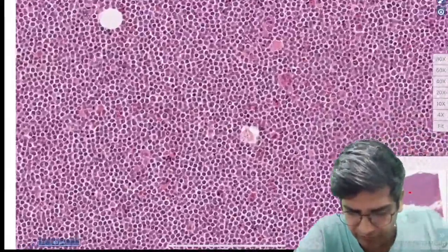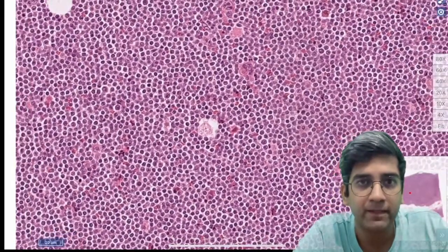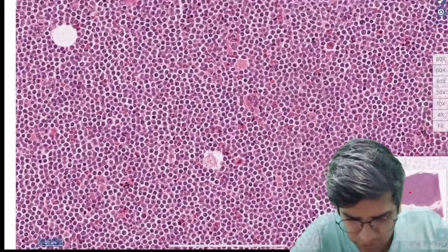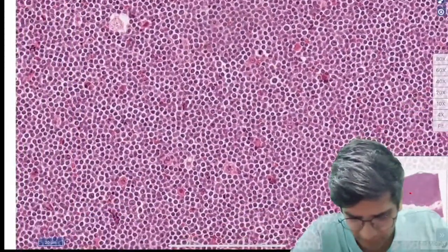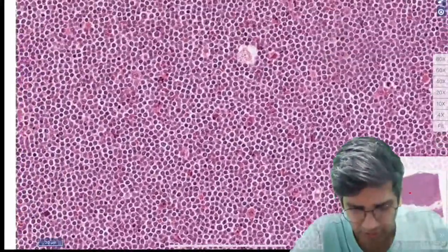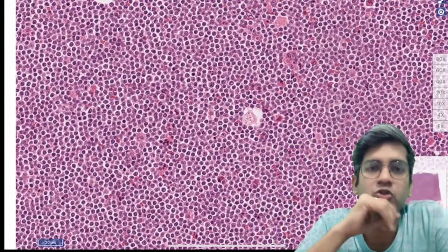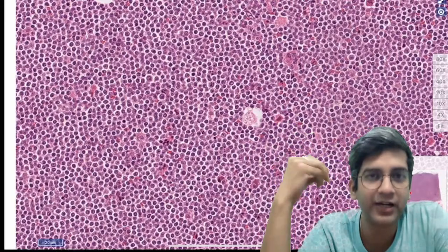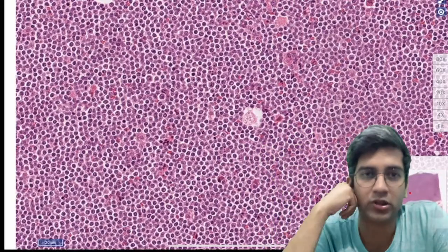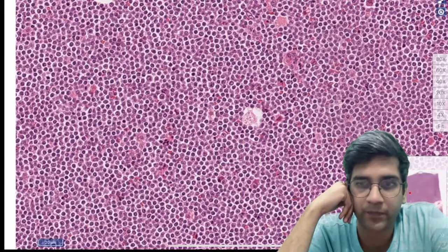So, are you guys comfortable in calling it a lymphoma? Yes, no, maybe. Yes, to some extent at least. How many of you are comfortable calling it a lymphoma for sure? Yes, no, maybe. If you're not comfortable, say no. I'll try to explain whether you're right or wrong. But I need a little bit of a solid answer so that we can go forward.